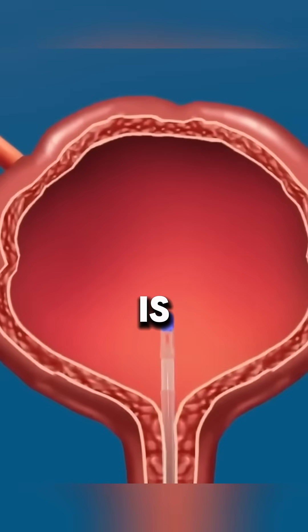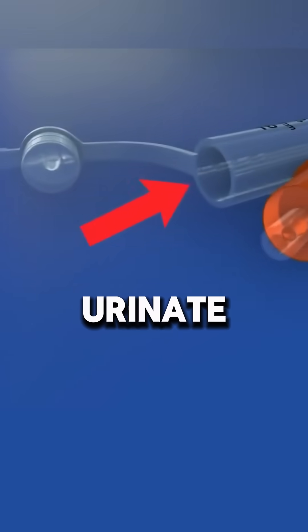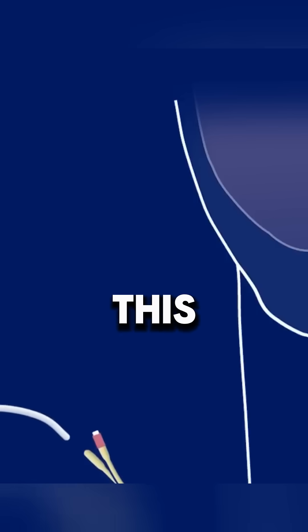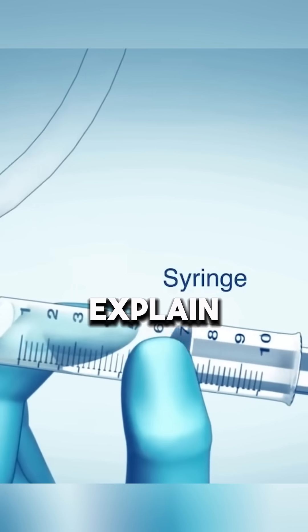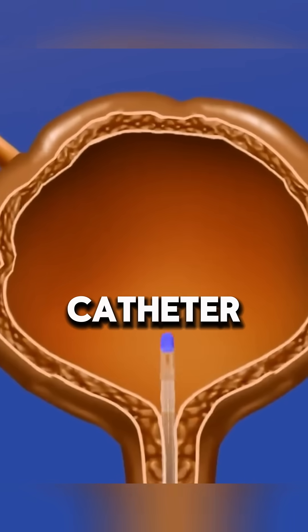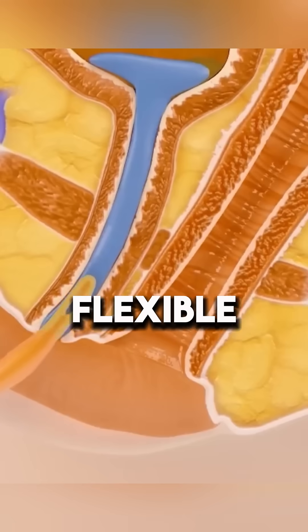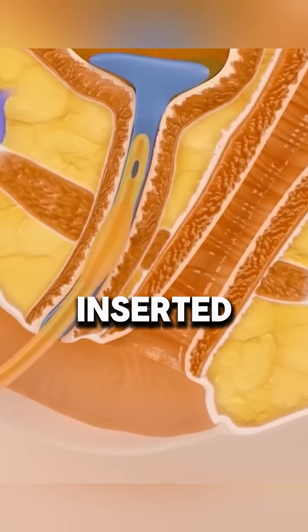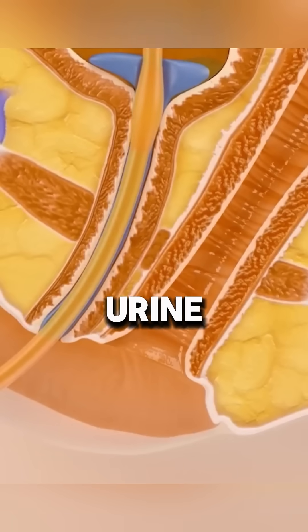Ever wondered how urine is drained when someone can't urinate? Save this video because we're about to explain. A Foley catheter is a sterile, thin, and flexible tube inserted into the bladder to drain urine.